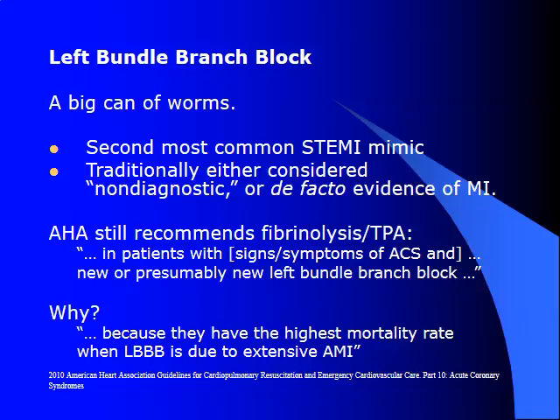Left bundle branch block is the next STEMI mimic we'll talk about. This is the second most common mimic. Traditionally, as we talked about earlier, the AHA noted that new onset left bundle branch block was the equivalent of a STEMI. Usually it's either considered non-diagnostic or it's just de facto evidence of an MI. The AHA does still recommend fibrinolysis for patients with presumably new left bundle branch block.